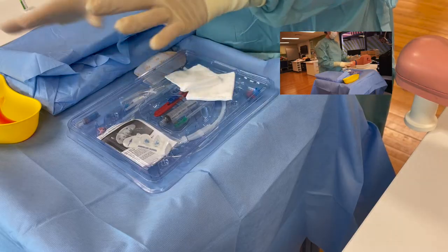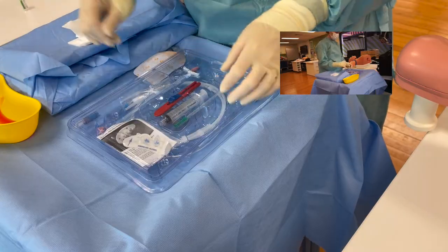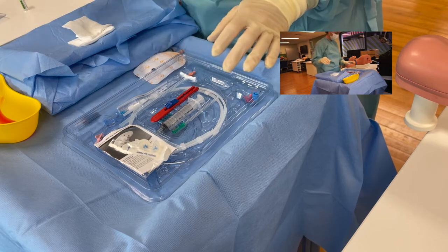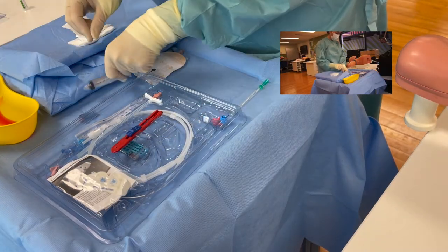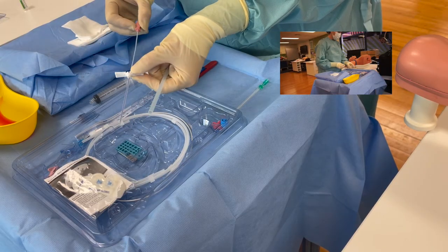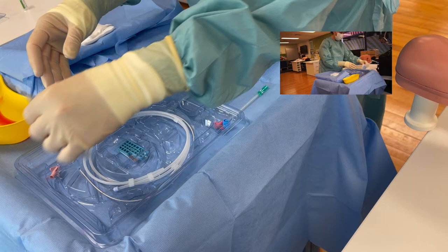I'm going to show you through this - your sterile field. You've got your chlorhexidine in the kidney dish here, which will later be used for your sharps dish. You've got some gauze for cleaning, your pick kit - just lift the lift tab and pass that off to your assistant to keep yourself clean. In here you have your needle, your syringe for your saline flush, your scalpel blade for making a nick in the skin, your dilator and introducer - make sure that's locked in - and then your stat lock, which you'll save for the dressing later.